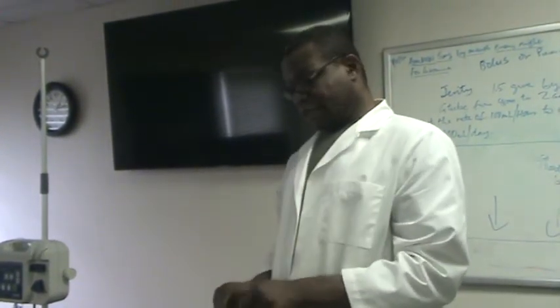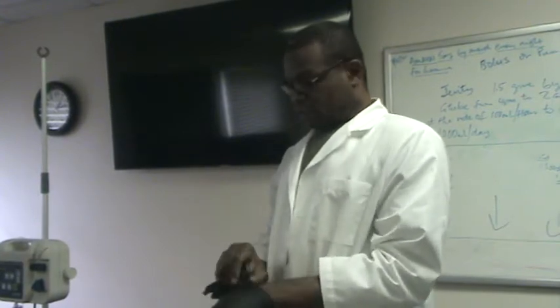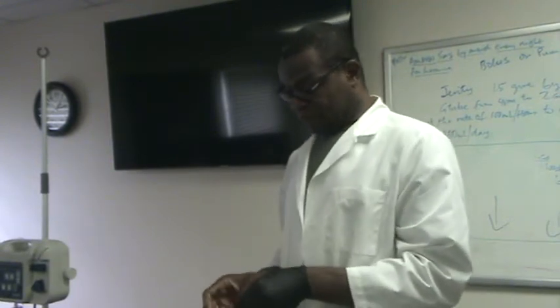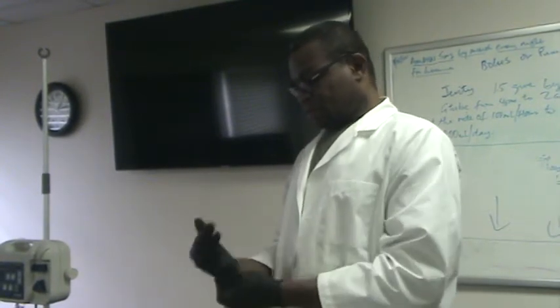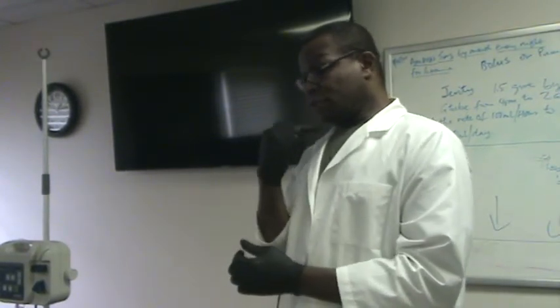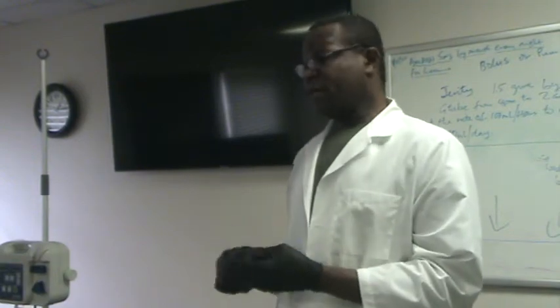because they have difficulty eating or swallowing and their weight is declining, they're not getting enough nutrients, or they have some kind of diagnosis that prevents them from eating anymore by mouth or swallowing or drinking. Nothing can go through the mouth. Sometimes because of lung cancer or a gunshot wound that penetrated the lungs, the throat, and they cannot swallow. So their medicine, water, food has to go by tube. The tube looks something like this.